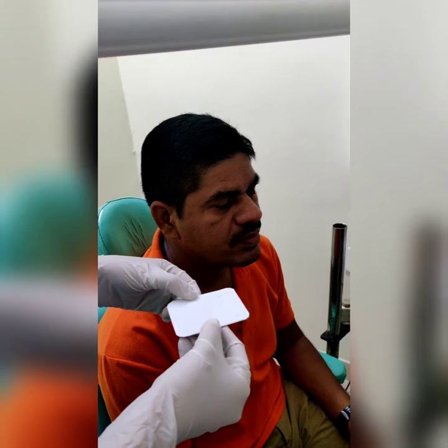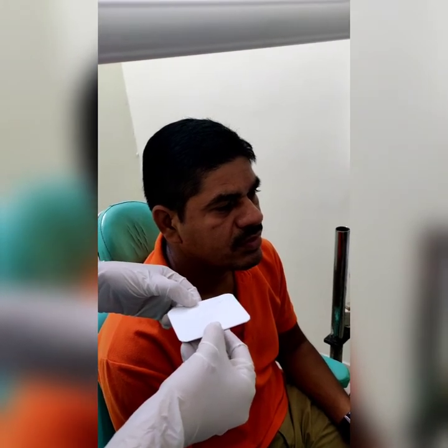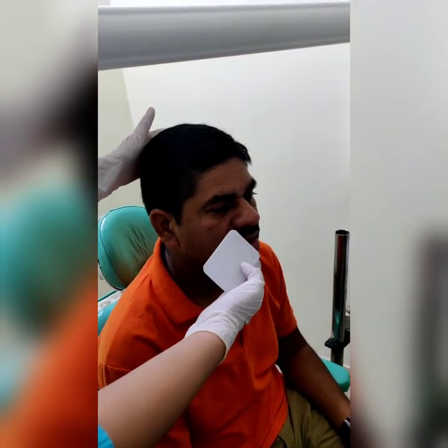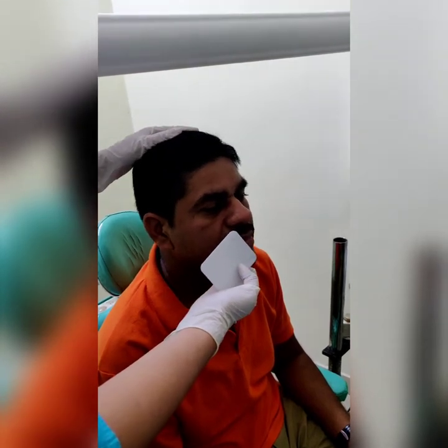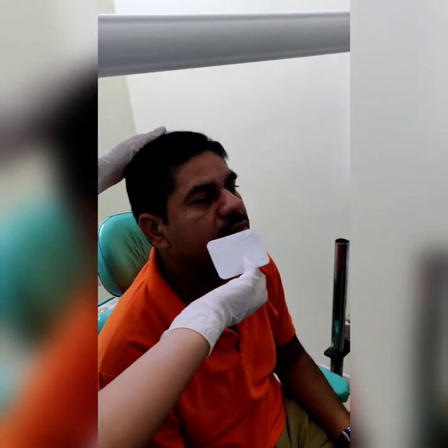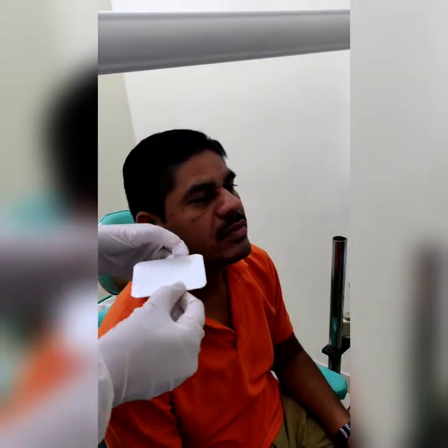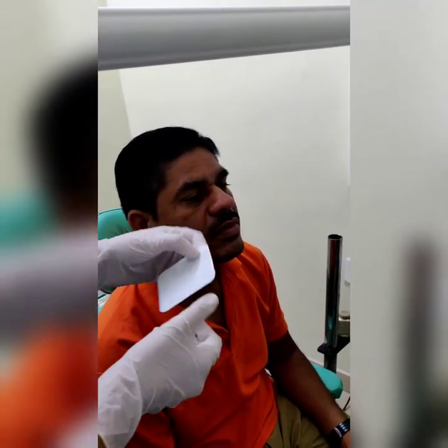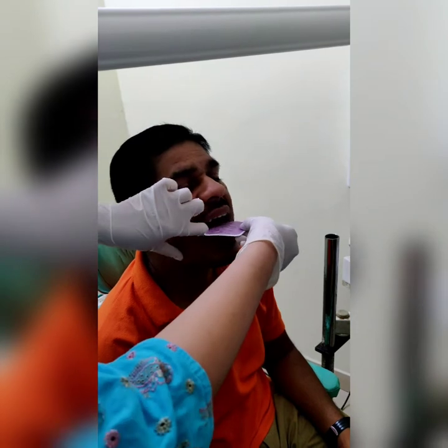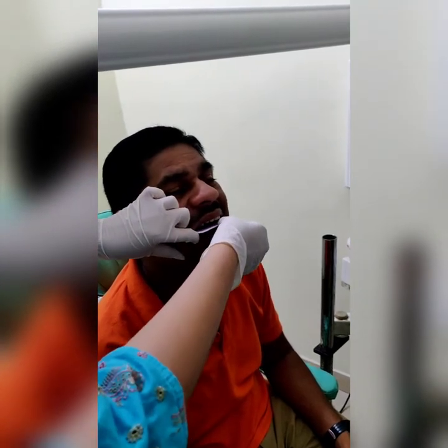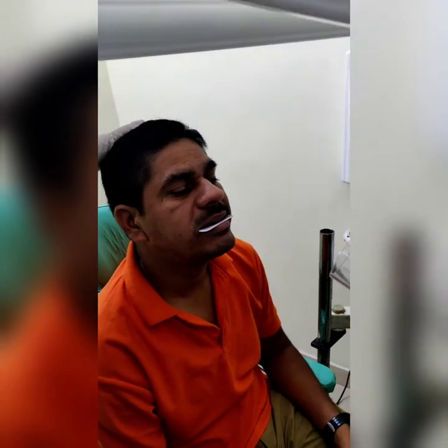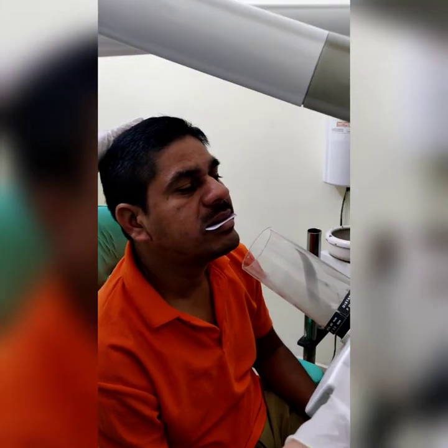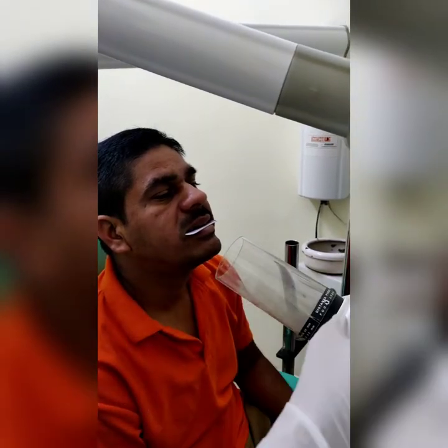For the mandibular anterior occlusal radiograph, the patient's head is placed such that the occlusal plane is at 45 degrees to the horizontal. The occlusal film is placed with the occlusal dot directed towards the mandible and floor. The patient is asked to slightly bite on the film, and the central ray is placed at an angle of 10 degrees pointing towards the tip of the chin.